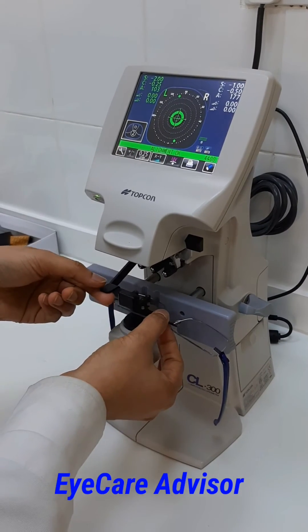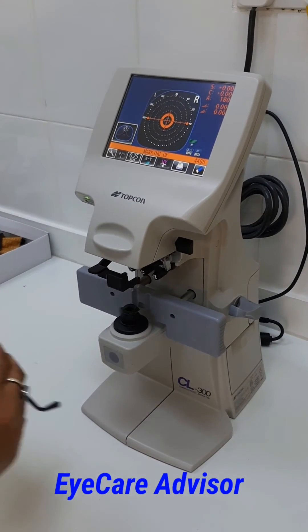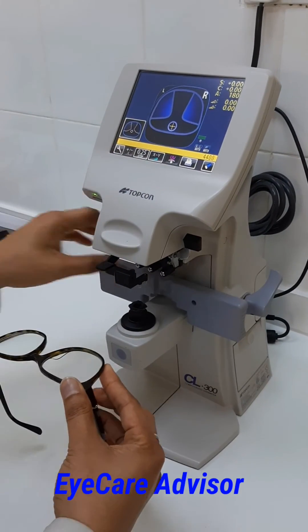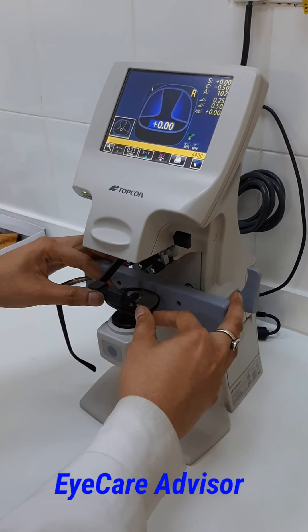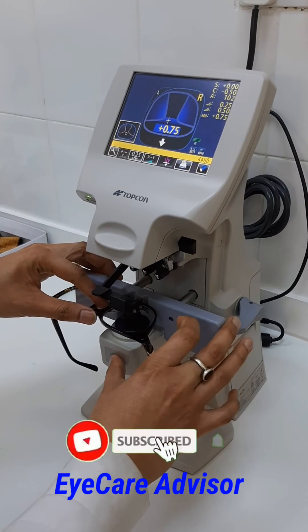Now I will show you how to measure progressive lenses. This is a progressive glasses frame. For progressive glass, you tap here to switch to the progressive mode — you can see the progressive lens variation appears. The steps are the same: put the lenses in and it automatically gets ready, then you change it and get the reading for the lens.